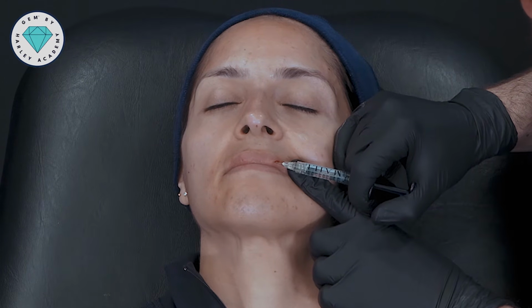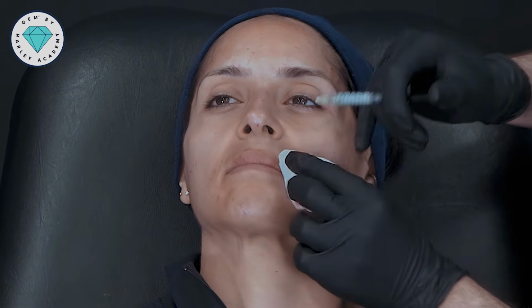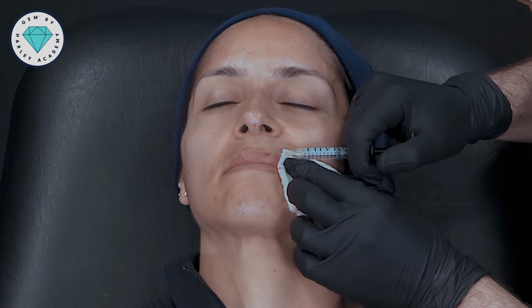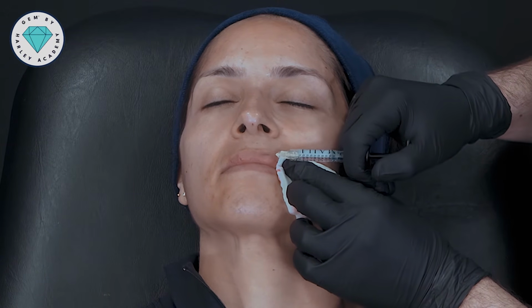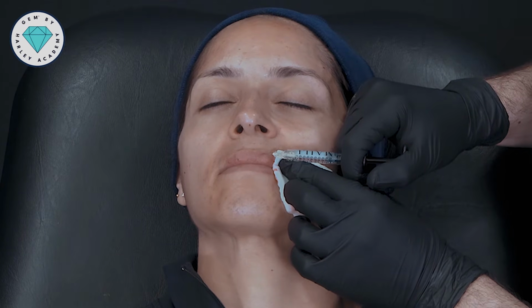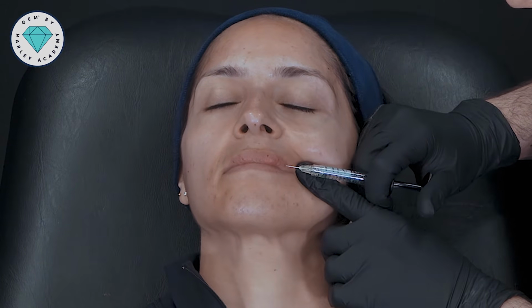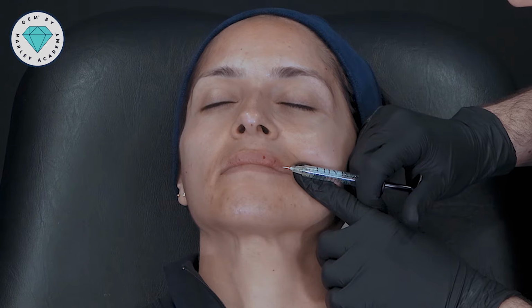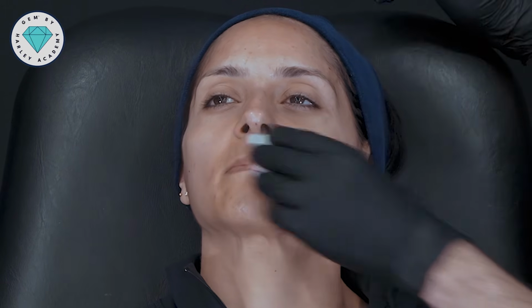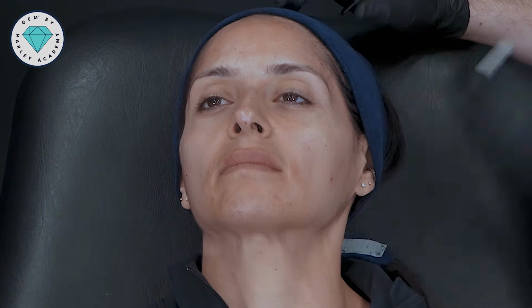Remember with the lips that the major vessels live usually behind the orbicularis oris muscle, and so this injection, even though I'm doing a bolus like this, I'm conscious that my depth is still in front of muscle. That's really, really important. We don't want to do this deep in the lips. So for me now, it's really kind of helped to balance the upper lip with the lower lip.